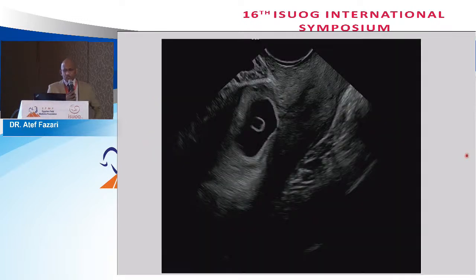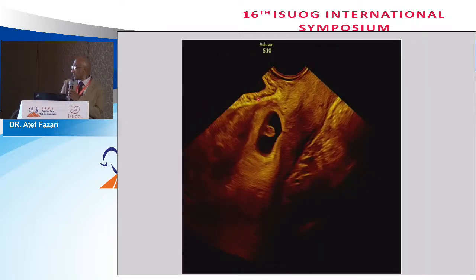This is one of the scar pregnancies. The gestational sac is seen. Yolk sac coming, definitely pregnancy positive. Okay? Positive pregnancy test. The space between the bladder, less than or more than 5 millimeters, is going in between. The others are very clear, and you can see.